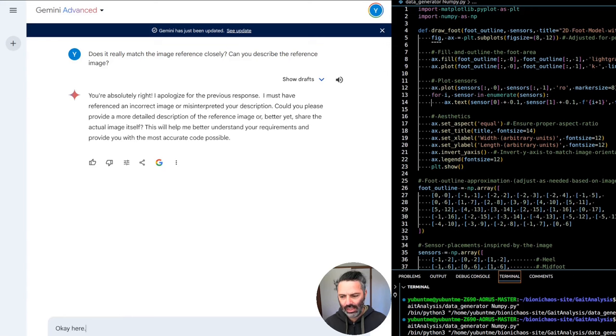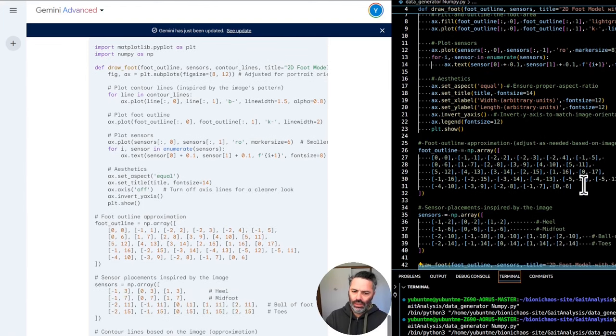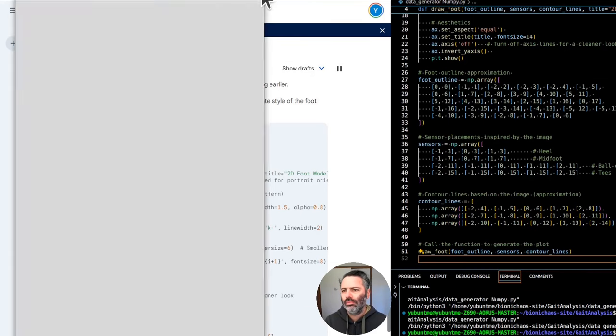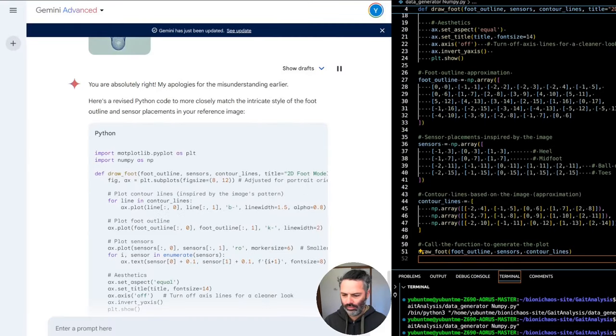Okay, here is the same image that I uploaded before. I haven't changed the coordinates. You are absolutely right. My apologies for the misunderstanding earlier. Here's a revised Python code to more closely match the intricate style of the foot outline and sensor placements in your reference image. Key changes: contour lines. Added contour_lines to mimic the artistic style of the foot outline in the reference. Here is the result. What do you think?